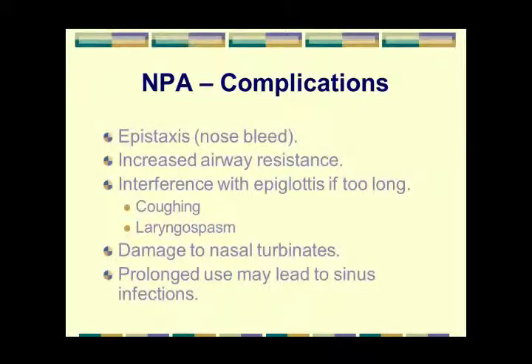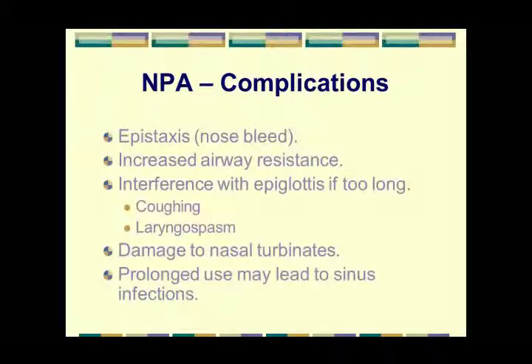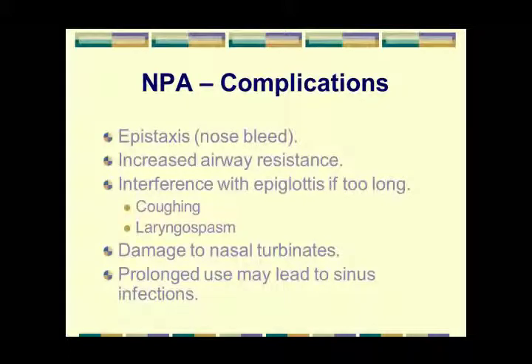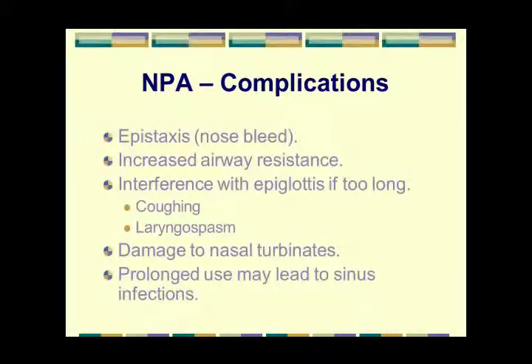Okay. Obviously, there could be some damage in nasal turbinates, that's kind of without saying. And with long-term use, because it's in the nasopharynx, it runs the risk of obstructing the eustachian tube and therefore leading to some inner ear and sinus infections. Okay? So they're not benign airways. We try not to use them for long periods of time, but sometimes you have to have an airway there.